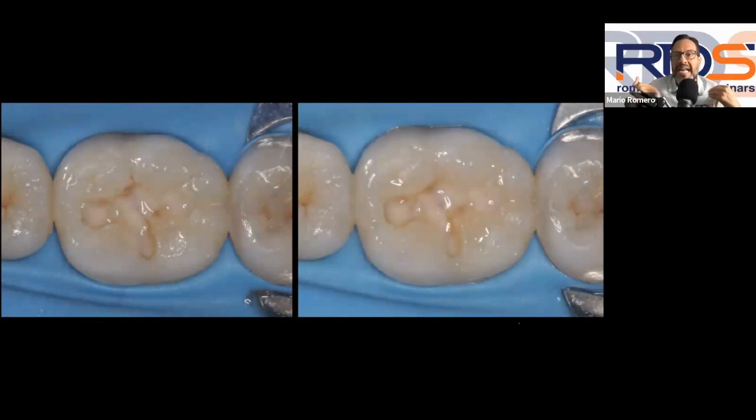So this is the system that I like using. And again, why? Because you don't want to etch this deeper dentin when your patient was in your chair because of hypersensitivity, because you can create even more sensitivity. So what you're trying to do is to protect or to seal that dentin with the mildest acid possible, or you seal that dentin with a liner like UltraBlend. That is what I decided to do for this particular case.